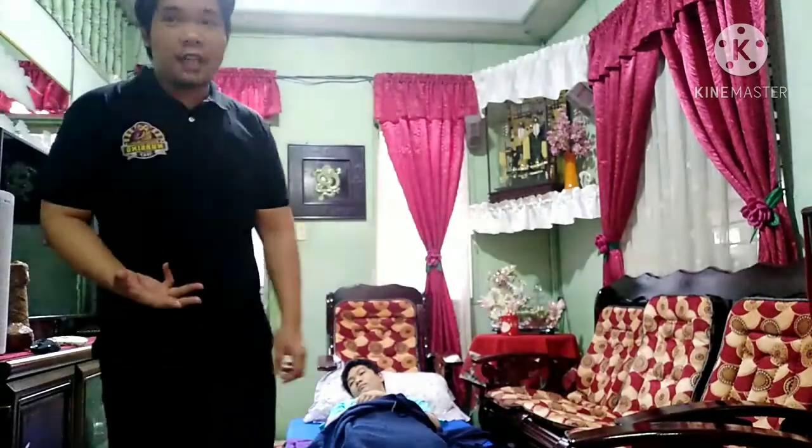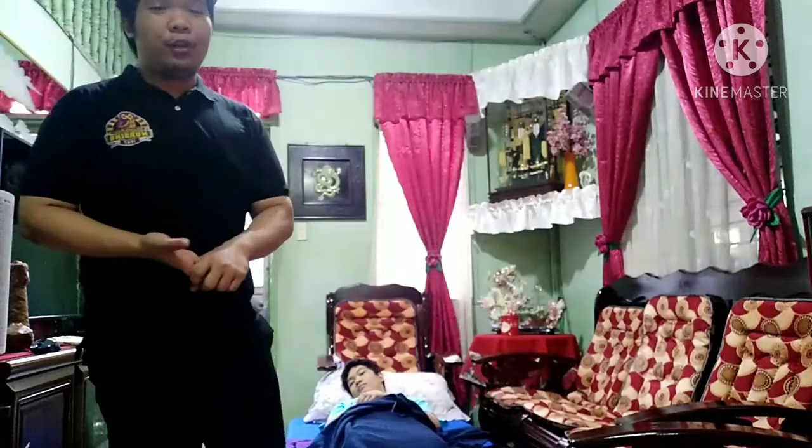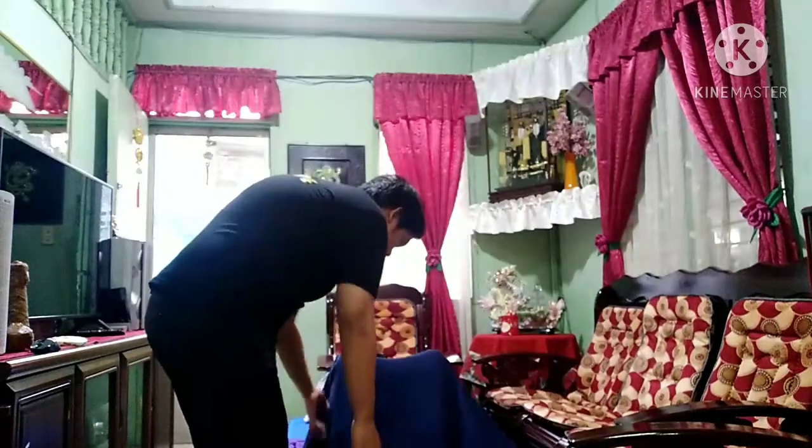After placing the waterproof pad on our patient, we go to step number 7. Facing the patient, stand on the left side of the bed if right-handed. Place the client into a dorsal recumbent position with knees flexed. Number 8, spread the blanket diagonally over the bed, leaving the genital area exposed.